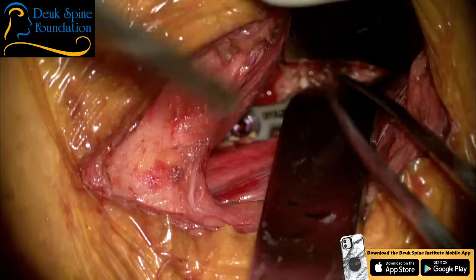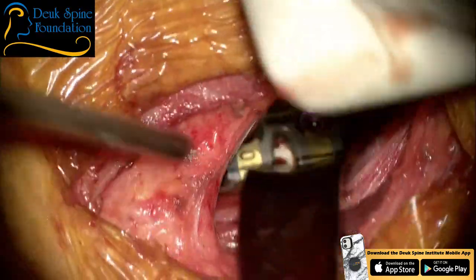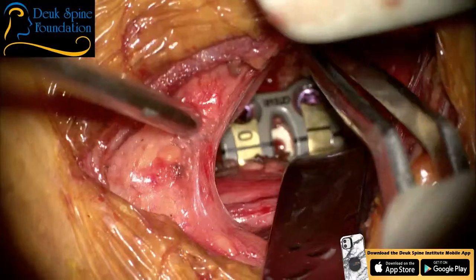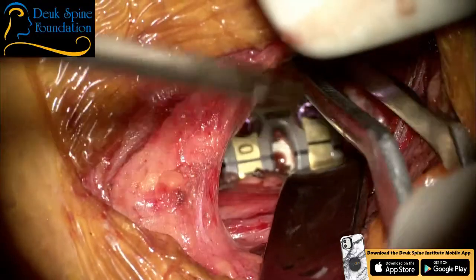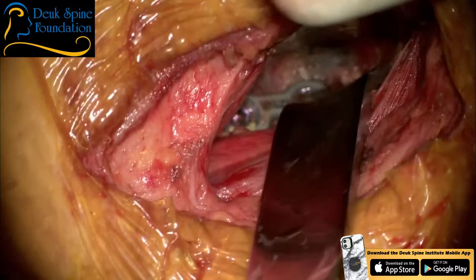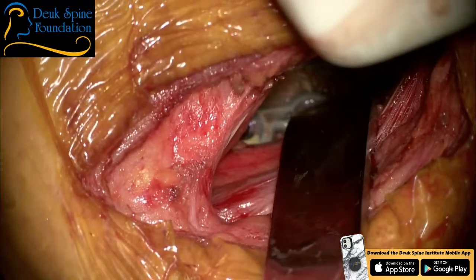I got to be able to see over here. Right. I got to see right over here. I need to see just under your retractor right here. Hey, let me have a gel foam and thrombin again. Okay. Luis, bring the gel foam and thrombin and put it here. Yes, sir.